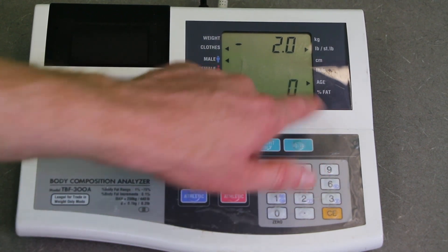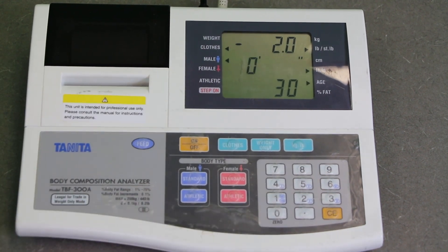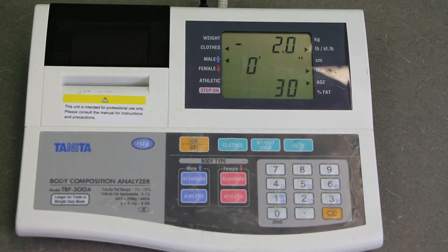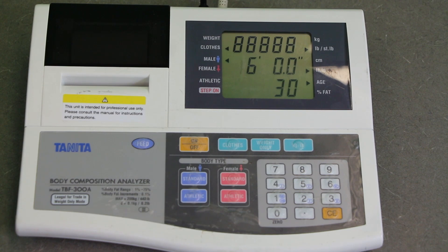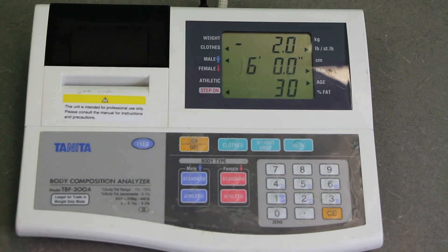Now the flashing arrow is next to age. This person is 30, so I'll type in 30. Now it's asking for height in feet and inches — if somebody is 5 foot 10, you type 5, then 10, and it also wants a decimal, so 5, 10, 0. This person is 6 foot, so it's going to be 6, 0, 0. Now the step-on arrow is flashing, so we're going to have the individual go ahead and step on.